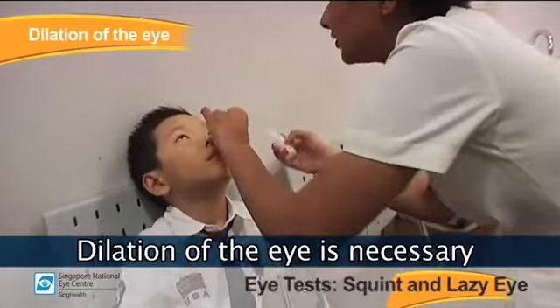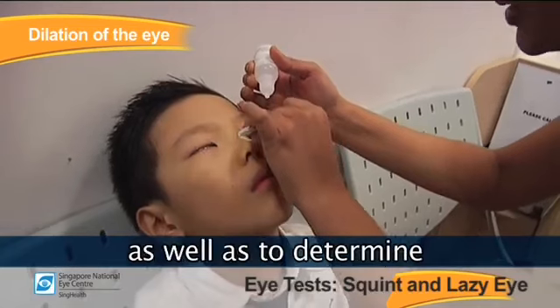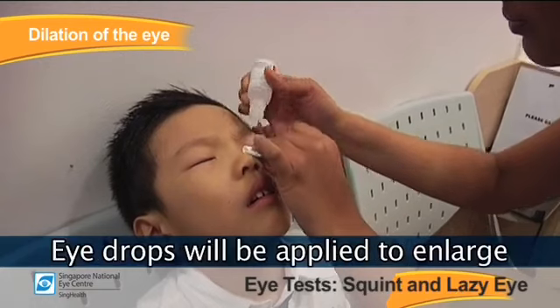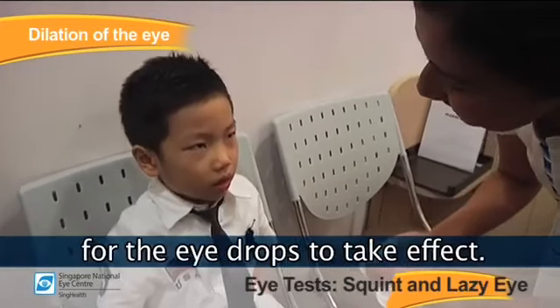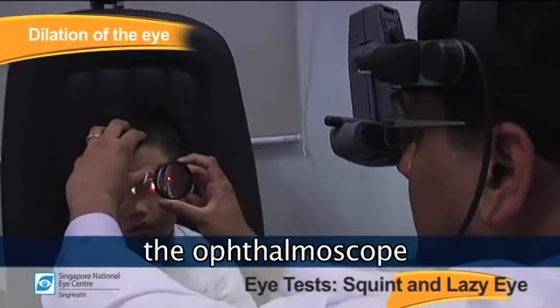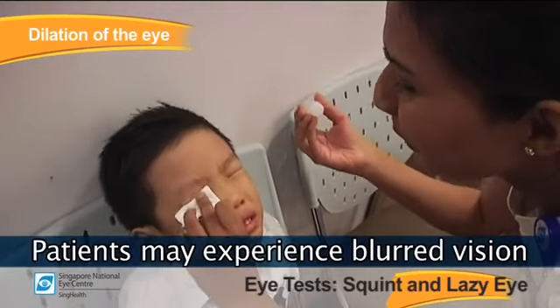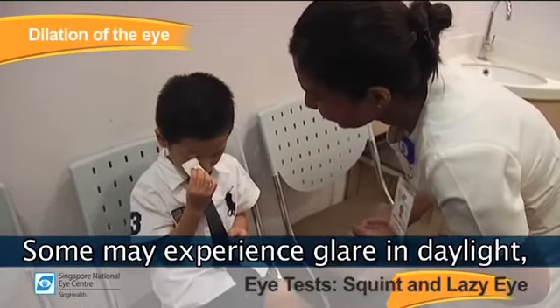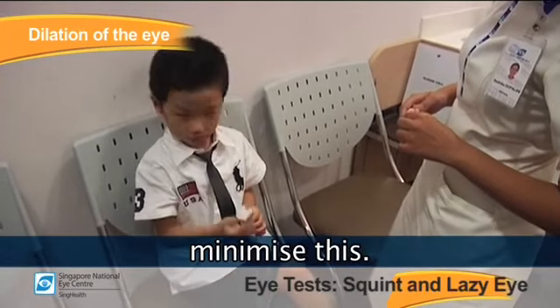Dilation of the eye is necessary for the eye specialist to examine the optic nerve at the back of the eye, as well as to determine if there are retinal diseases. Eye drops will be applied to enlarge or dilate the pupil. About 20 minutes is required for the eye drops to take effect. The eye specialist will then use an instrument known as the ophthalmoscope to examine the eye. Patients may experience blurred vision after the dilation for up to 4 hours. Some may experience glare in daylight, and in these instances, wearing sunglasses may help to minimize this.